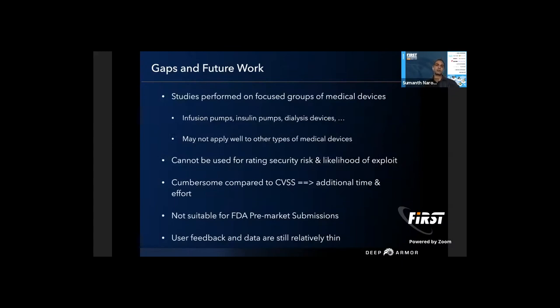And lastly, while this is showing a lot of promise, there are certain gaps and more work to be done. Some of these studies have been done on very focused groups of medical devices, so it may not apply to all kinds of medical devices. And this guidance is not suitable for pre-market submissions. This is not for evaluating risks and vulnerabilities in the architecture and design. This is more for device-level vulnerabilities. And essentially the feedback and data is still relatively thin.